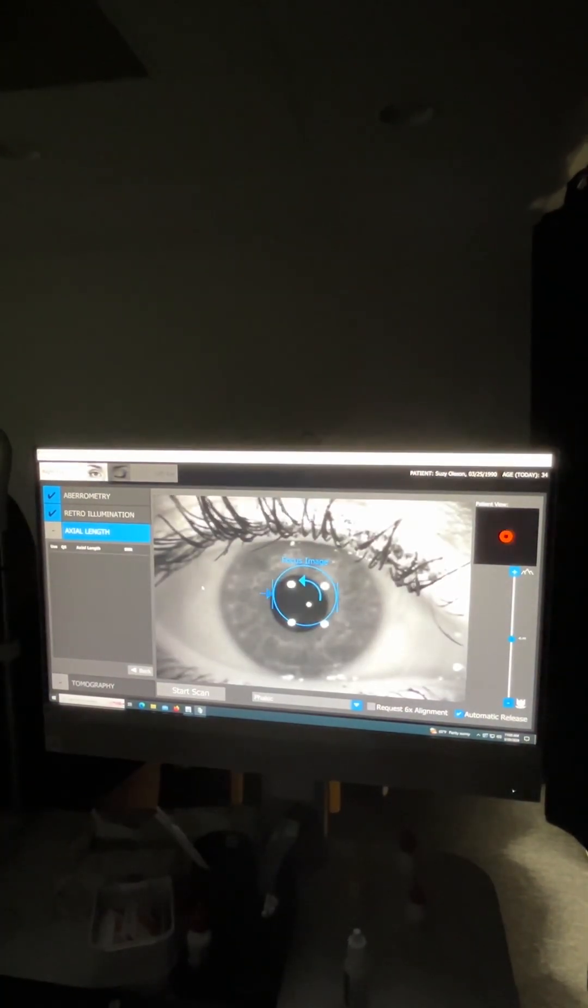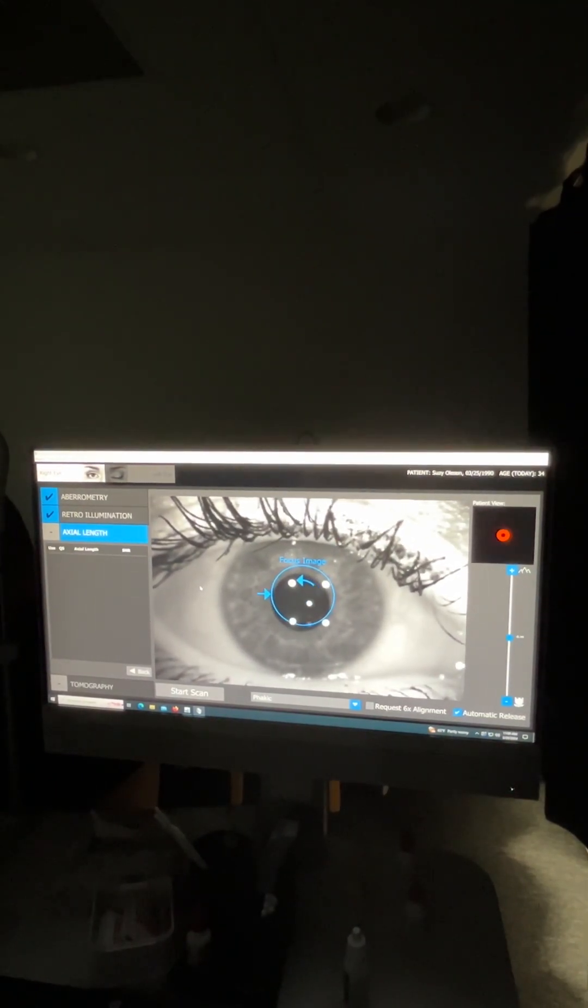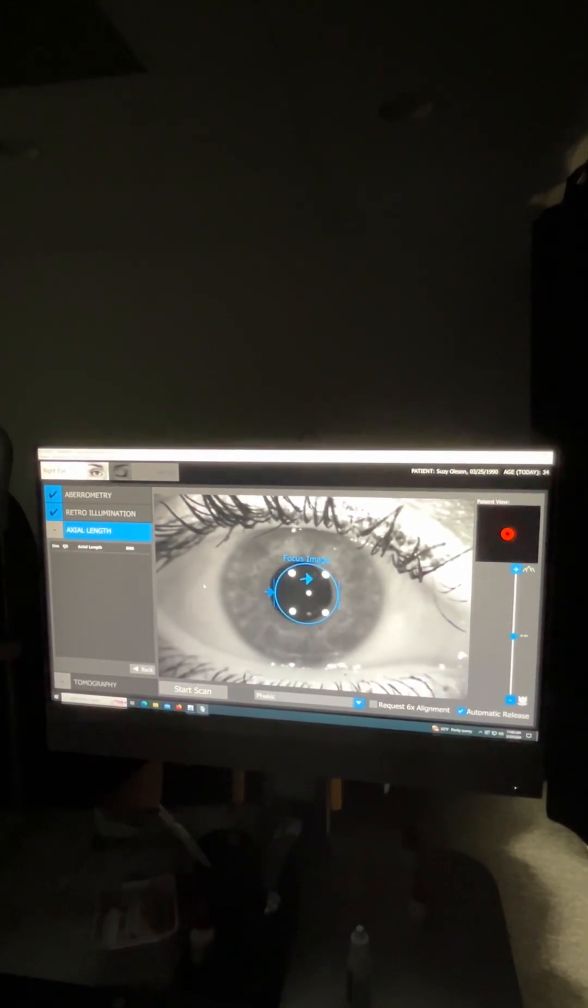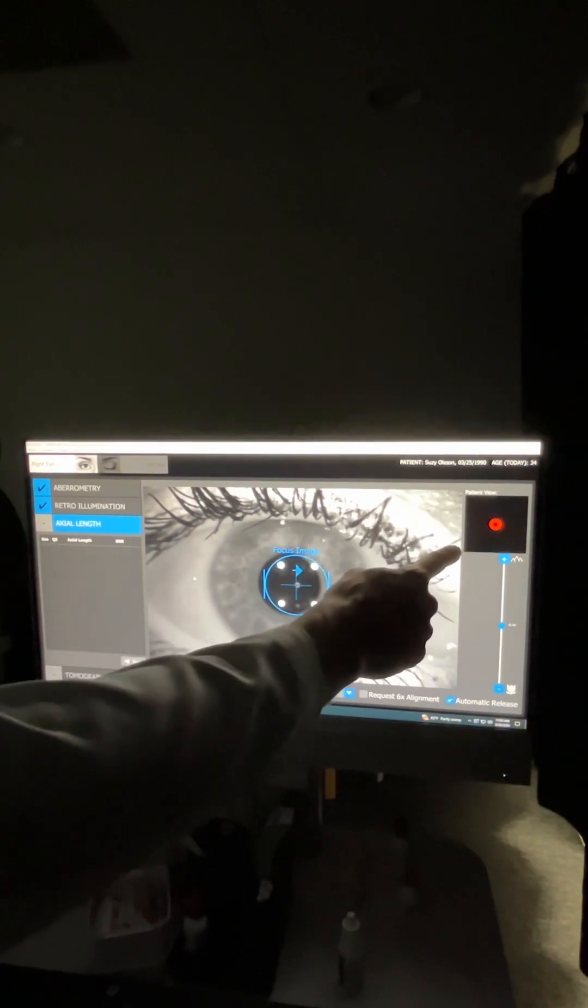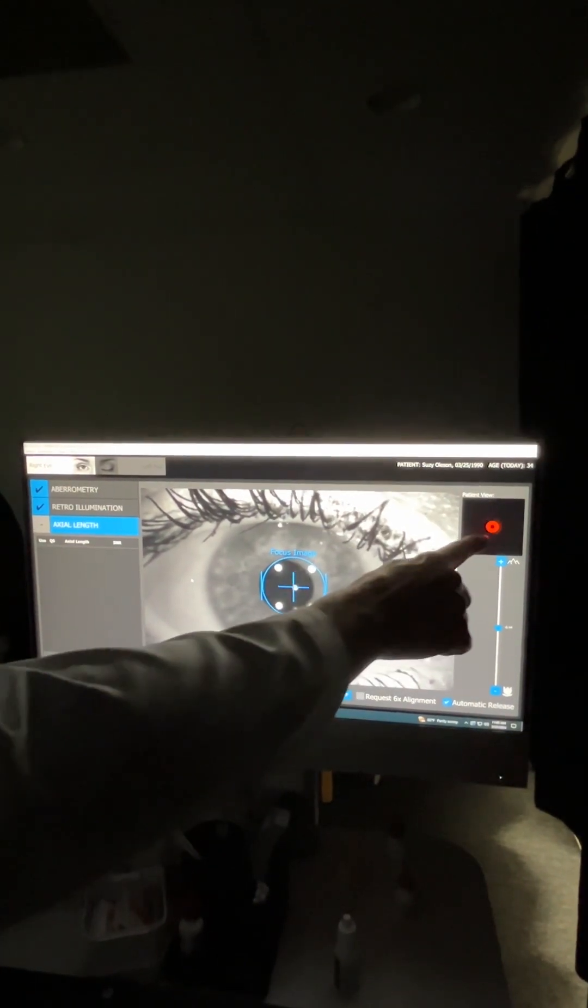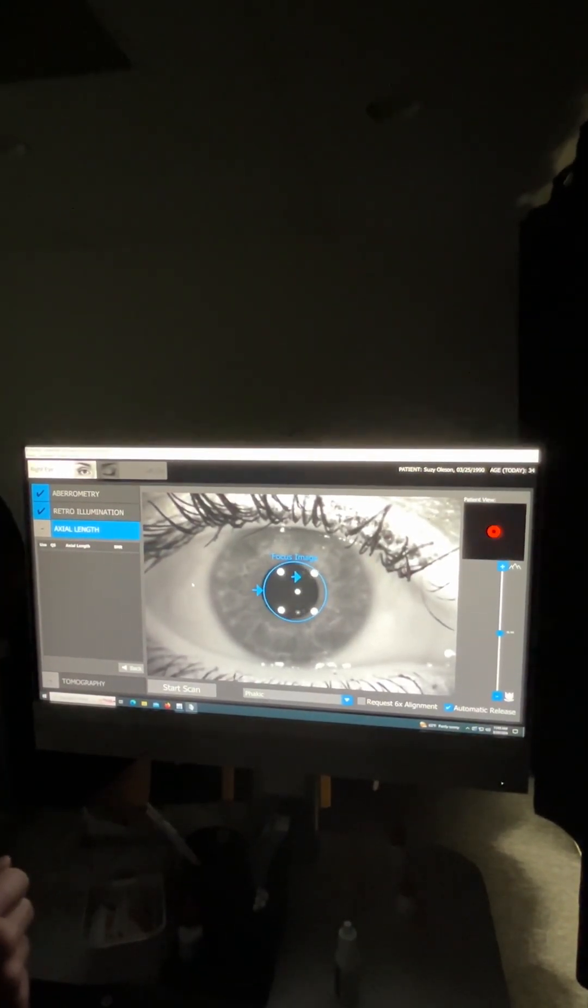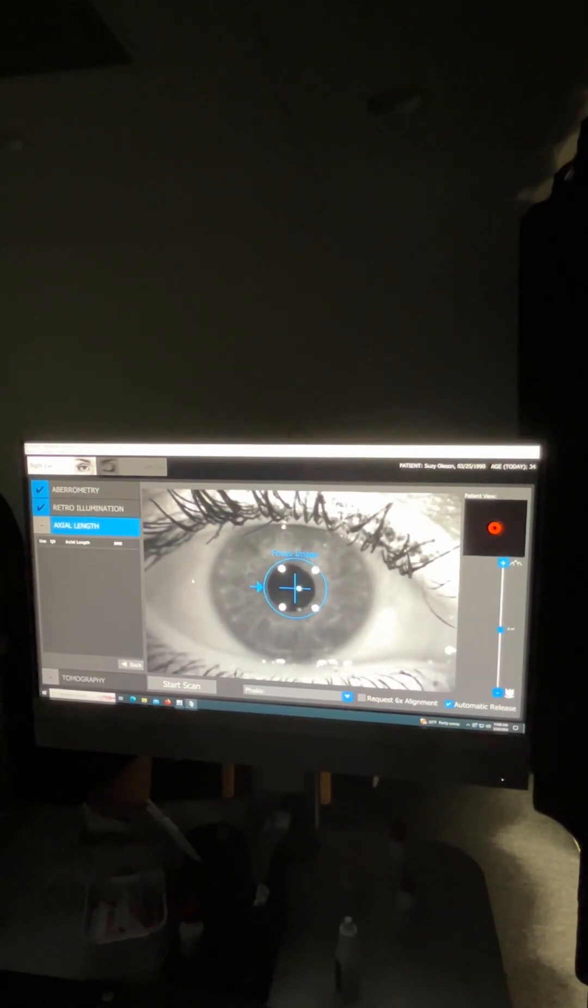Susie is phacic still like most of our patients. And then this will be similar. So at this point, their patient view changes and they're going to see a red dot, kind of a flashing red light. That's the fixation. So you just focus on the red light.